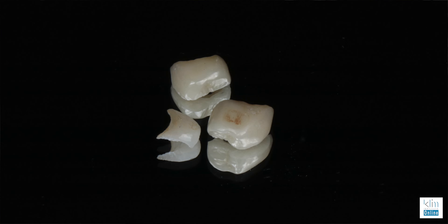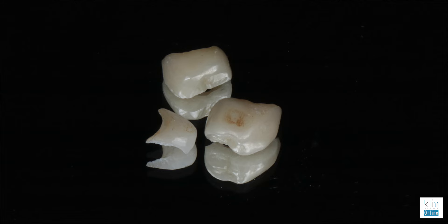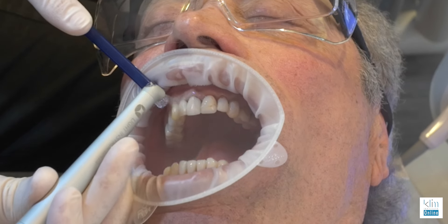What was interesting about removing this restoration was I went ahead and sectioned it — like we have removed hundreds of crowns in our career — we use a separator and ease those parts off the tooth. That worked quite well, but it was difficult getting this crown off, and at her age this was an endo tooth. I didn't want to see a portion of the tooth come off with the crown being removed. Now, if that had been bonded in, that would have been very difficult to remove. If you have an Erbium YAG laser, that always helps loosen the cement, but a lot of people don't. I've had messages on social media about creating a hemisection trying to remove a bonded restoration, and now that we're seeing that with zirconia, it's something we have to pay attention to.